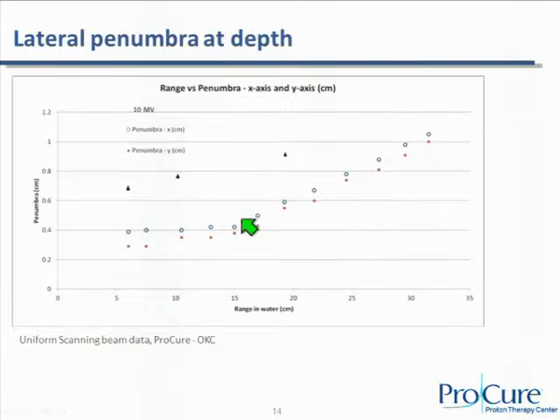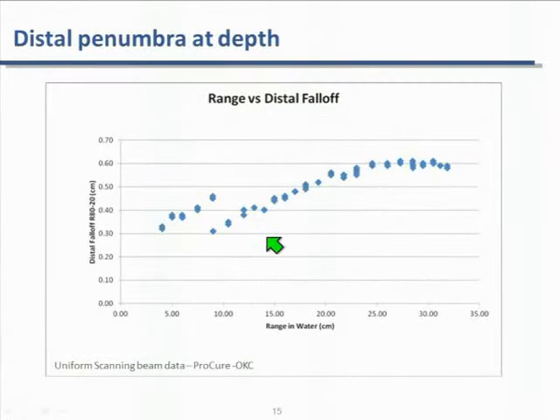Another interesting thing is that most proton delivery systems have an SAD that's actually twice as large as X-ray therapy. LINACs have an SAD of 100 cm. Most proton systems have 200 cm or so. So despite the geometrical disadvantage, you still have protons beating most X-ray penumbras at various depths, which is very good news.